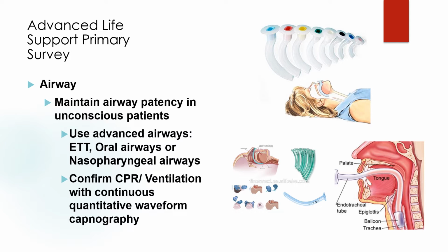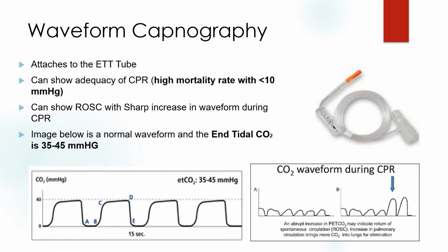We're going to be confirming CPR and ventilation with continuous quantitative waveform capnography. So waveform capnography attaches to the ET tube or the ambu bag. It can show adequacy of CPR.